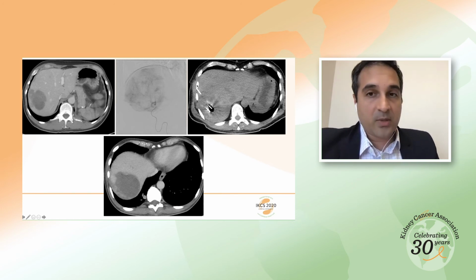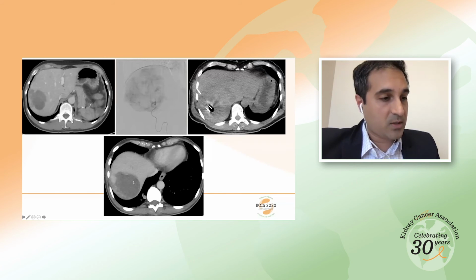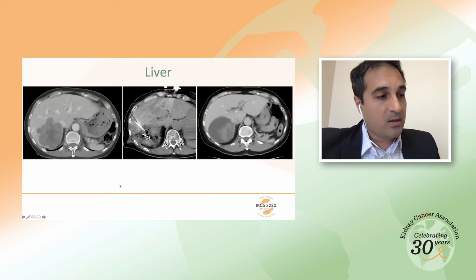This was then followed by microwave ablation, and if you've ever seen one of these procedures, this dark oval surrounding one of the ablation probes is actually steam, since we heat the tissue to greater than the boiling point. And at 1 year follow-up with a combination of these procedures, you can see the lesion remains under excellent local control. Similarly, this is another patient with a very large liver metastasis, and we treated this in the same manner, combining embolization with ablation, and 2 years out, the patient remains with excellent local control.